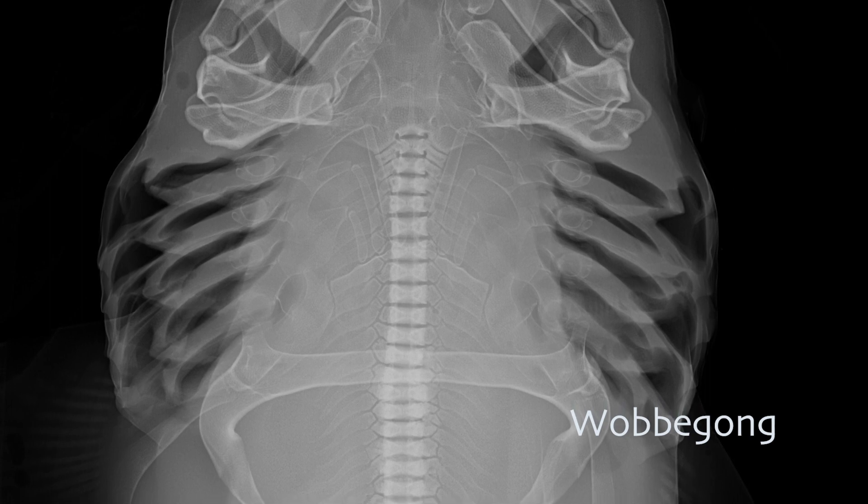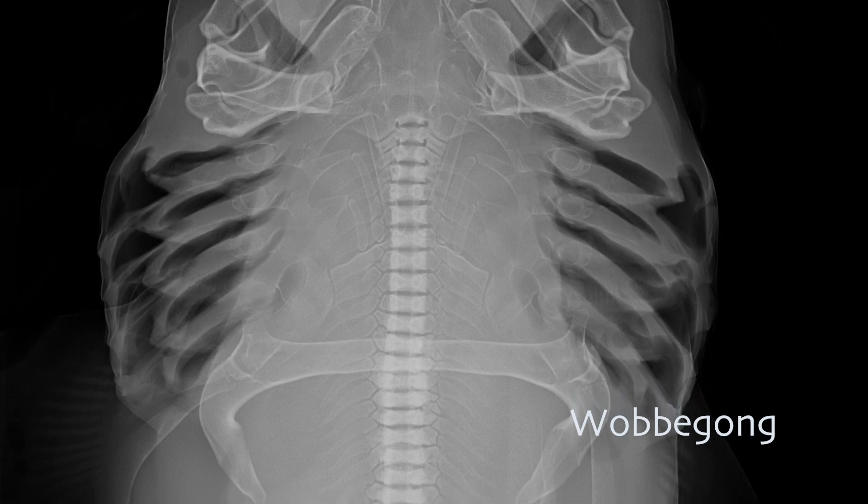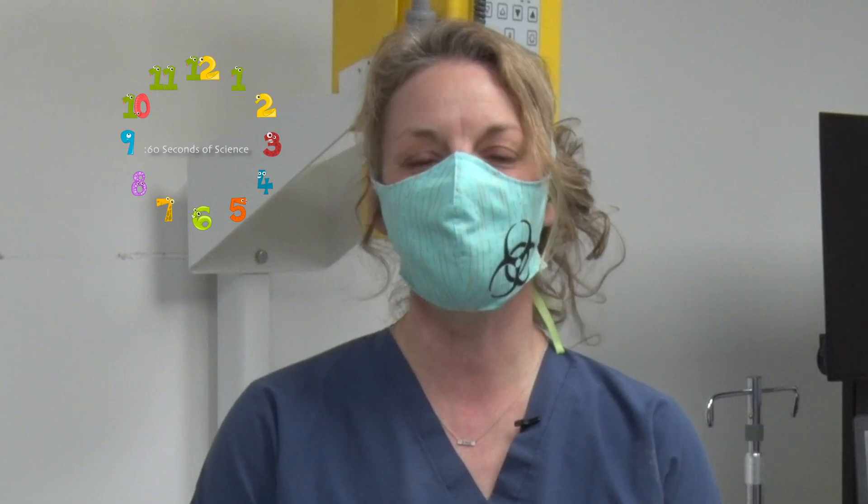Are we looking at an organ? Are we looking at a bone? Are we looking at a tooth or soft tissue? Our veterinarians can then make a determination of whether that's normal or if maybe something else is going on. Thanks again for listening. I hope you enjoyed this 60 seconds of science.